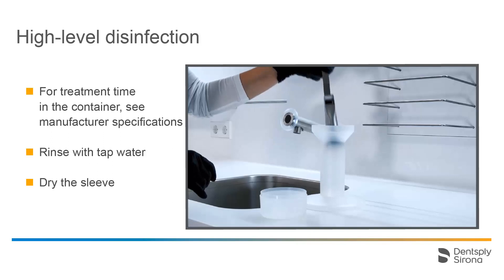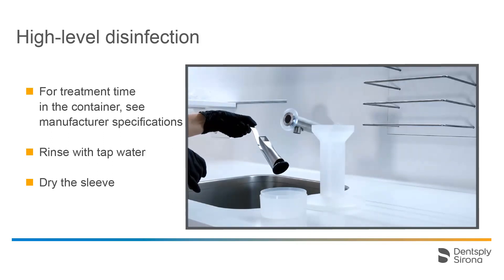At the end of the treatment time, we remove the metal bracket with the sleeve and rinse everything with tap water. Please follow the manufacturer's recommendation regarding the length of the rinse. Then we carefully remove the sleeve from the holder, making sure that no liquid gets into the inside of the sleeve. We dry the outside of the sleeve as well as the inner part where the plug was with a lint-free cloth. Now the sleeve can either be reattached to the scanner immediately or it can be stored in an area protected from contamination.